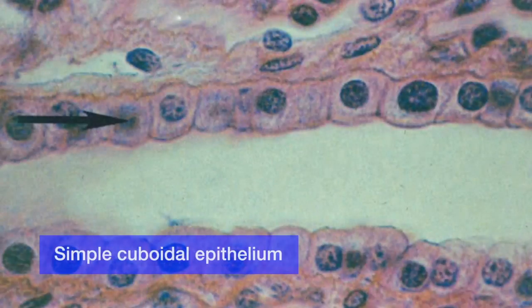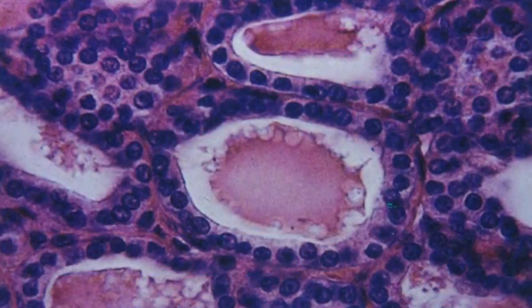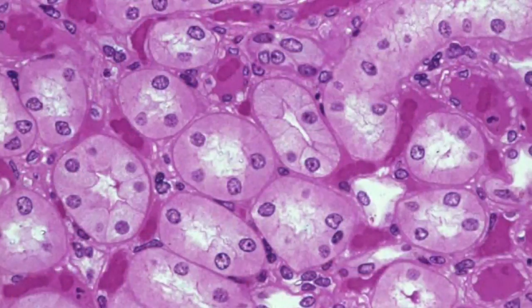Simple cuboidal epithelium. As you see, a single layer of cube-shaped cells and a spherical nucleus in the center of the cell. The arrow is pointing at the nucleus in the middle or center of the cell. Next slide, the same simple cuboidal epithelium. And the next one, simple cuboidal epithelium.